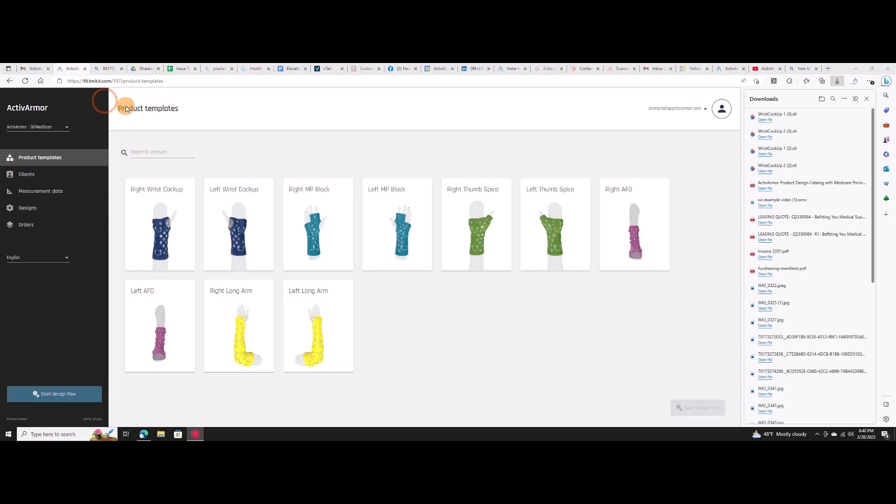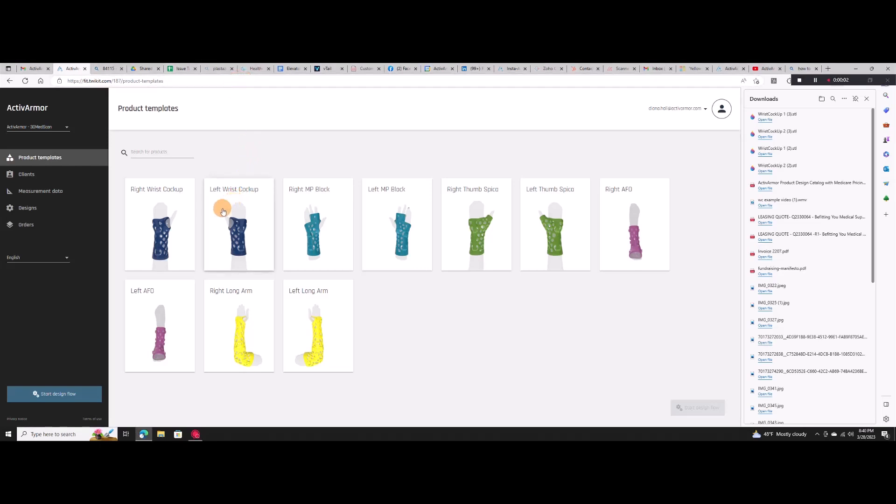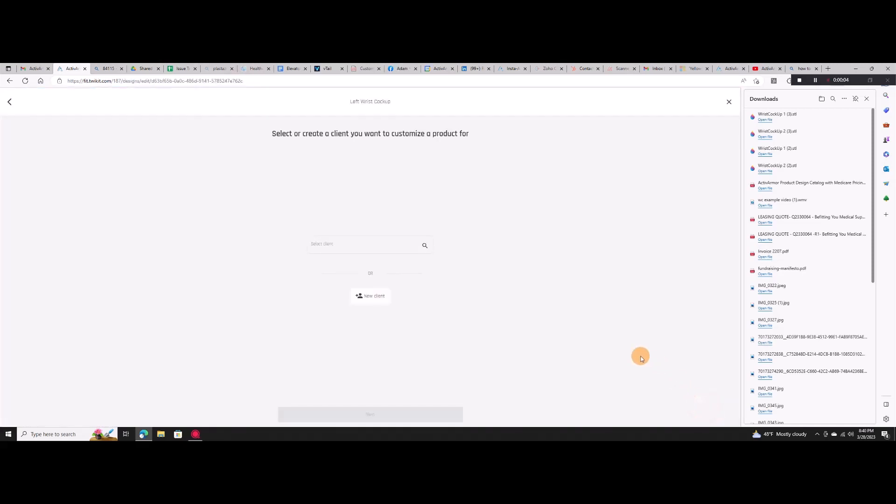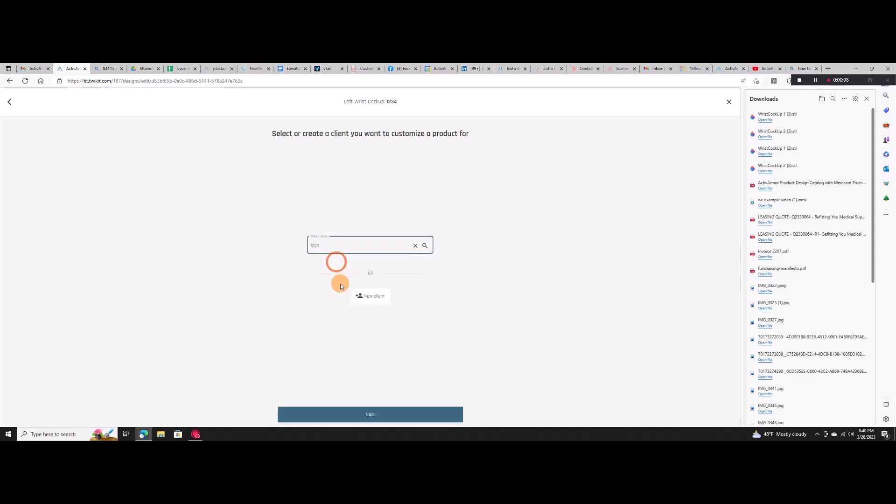ActiveArmor Design Software allows you to easily create fully custom 3D printable designs for hands, wrists, fingers, elbows, and feet in minutes. Just choose the type of caster splint you'd like and upload a patient scan file for custom fitting.